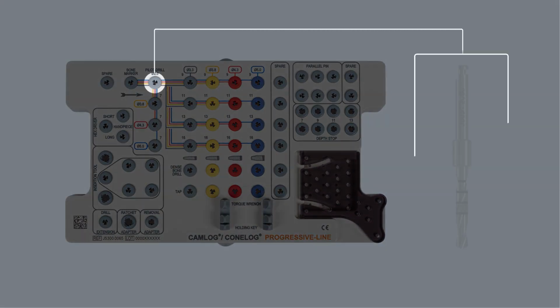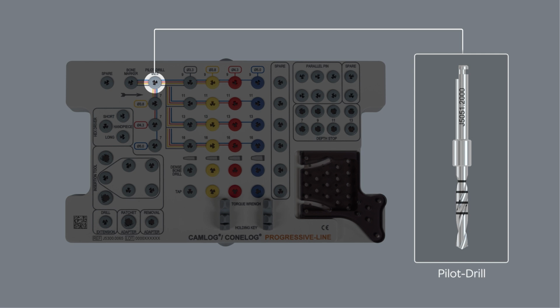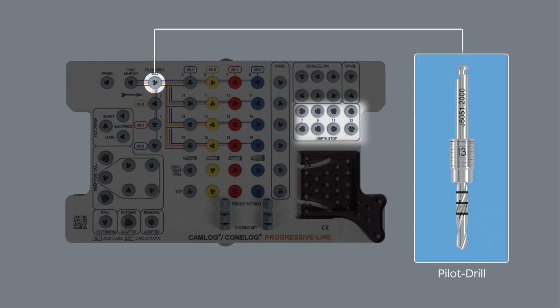The pilot drill determines the depth and axis of the implant site. The depth marks on the drill correspond to the implant lengths 7, 9, 11, and 13 mm. For safety reasons, a depth stop corresponding to the planned implant length should be used.